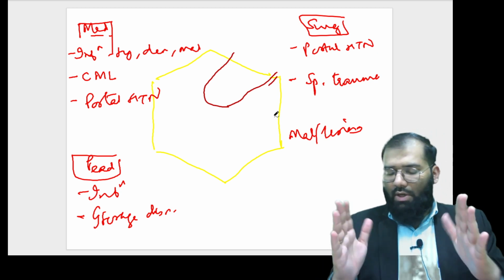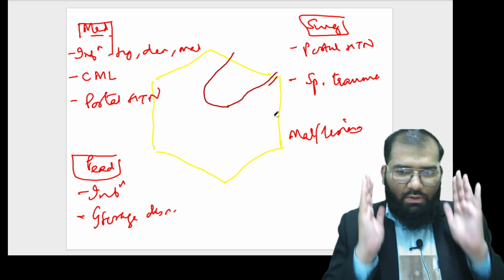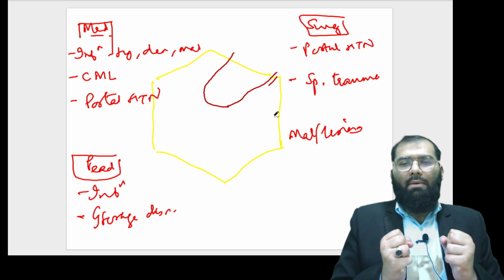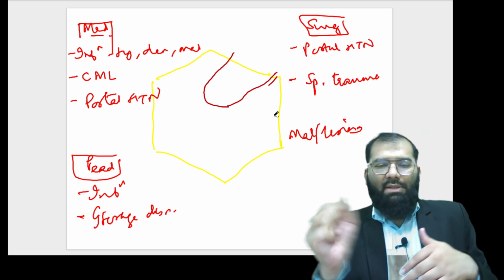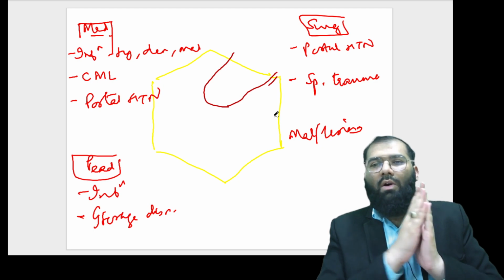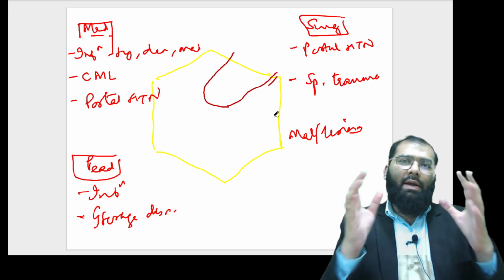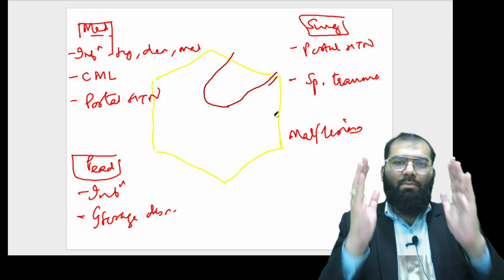So here I stop this session. This session was to make a sonographer's brain think the way a clinician thinks, so that when patients come to us, we are not merely doing tailor work, that is measuring the liver, measuring the spleen and giving it off, but we think from a physician's or surgeon's point of view, and we try to help the patient and the referring doctor, so that the entire diagnosis is well made. Hope you have enjoyed the session. Your feedbacks are most welcome.